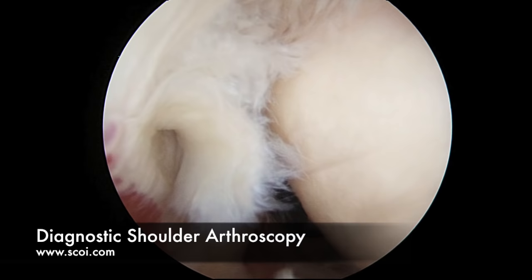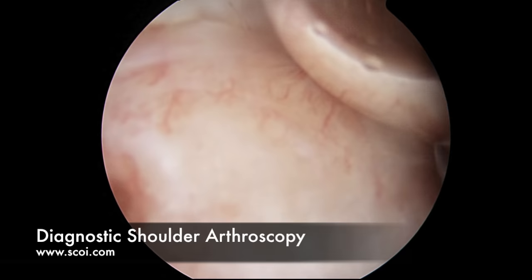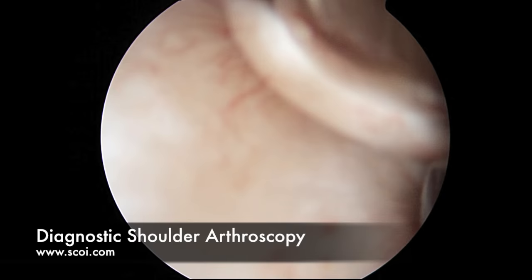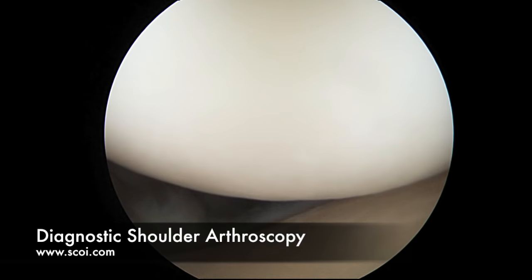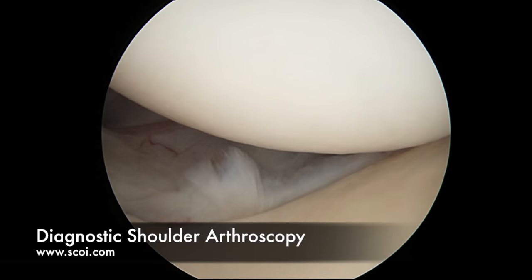Coming more posteriorly, we'll follow the rotator cuff all the way around the back of the humeral head. There's a normal little spot that doesn't have any cartilage called the bare area, but the posterior aspect of the rotator cuff is fully intact. Now the ball of the ball and socket is next in our diagnostic exam. It should look like a white cue ball — and in fact it does. There's no signs of cartilage damage, potholes, or erosion. Another name for that type of damage would be osteoarthritis, and this shoulder does not have any.